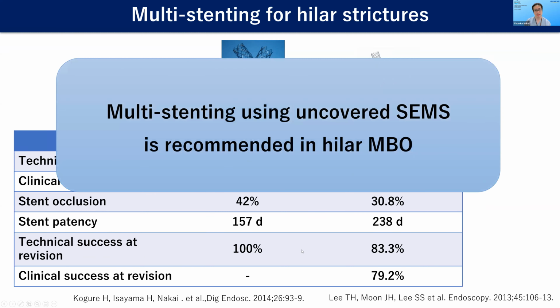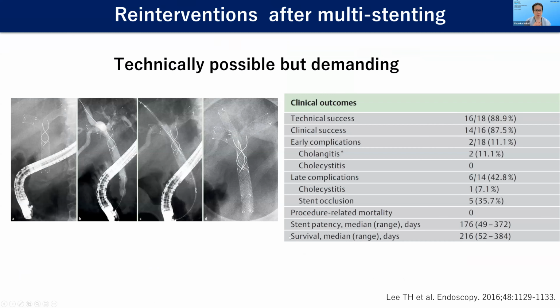However, it's technically possible but still technically demanding. Sometimes we fail to put the stent through the previously placed stent. So we need very high skills to perform re-intervention after stent occlusion in those multi-stentings.